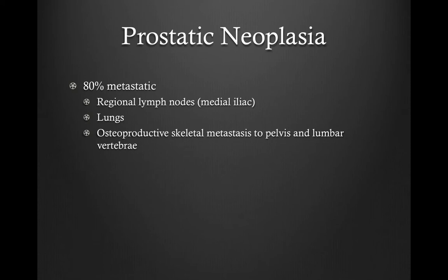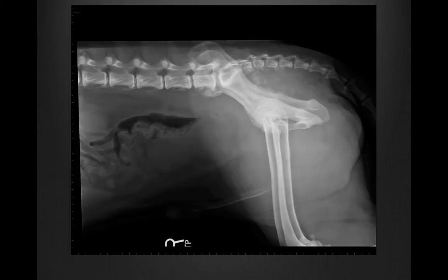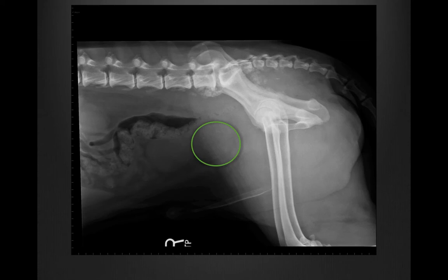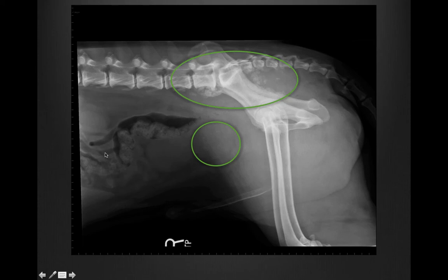Prostatic carcinoma is metastatic 80% of the time. It metastasizes to the regional lymph nodes — including the medial iliac or other sublumbar lymph nodes — to the lungs, and also causes osteoproductive skeletal metastases to the pelvis and lumbar vertebrae, which is a relatively unique feature. The dog in this case had new bone on the medial aspect of his ilium. In this different dog, you can see the mass caudal to the urinary bladder with focal mineralization, but importantly, there is irregular amorphous new bone ventral to the lumbar vertebrae, along the ilium, and ventral to the caudal vertebrae. This is different from normal smooth spondylosis deformans and is a feature of metastatic disease from prostatic carcinoma.